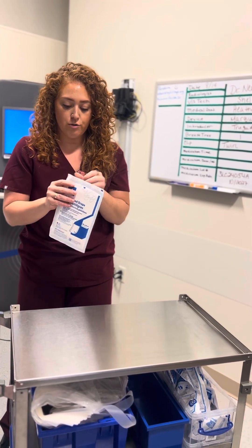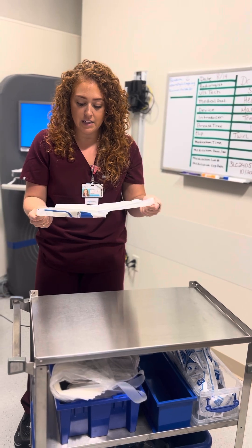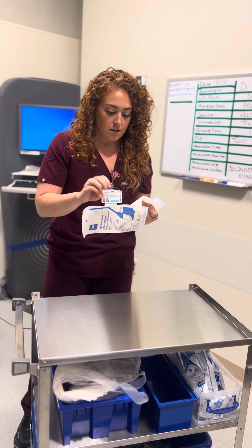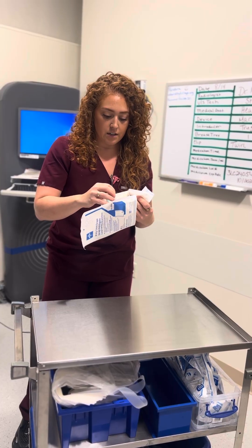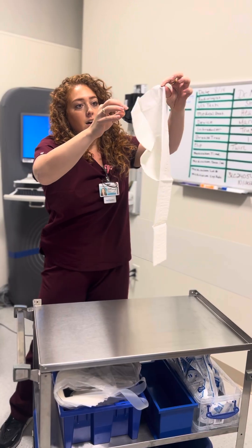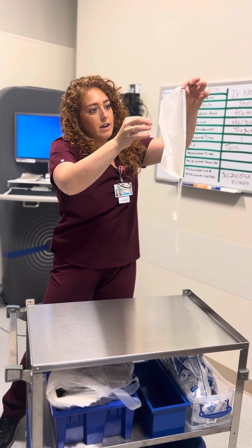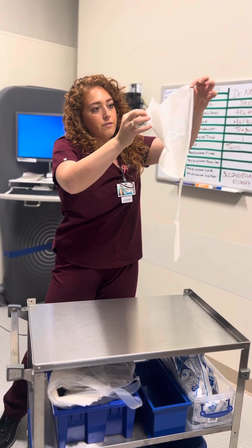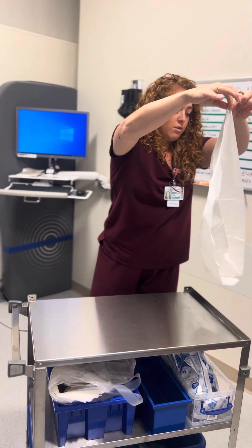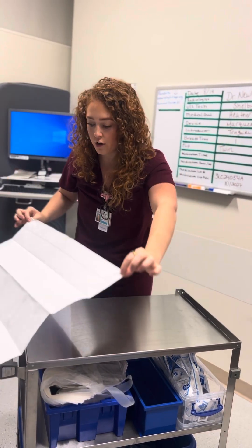I'm going to take the polyline drapes and open those so I can set up my sterile field. My tray is clean — always start with a clean surface. Now these are sterile drapes. Rule of thumb: the one-inch border around them is not sterile. So I'm touching it, but I'm only touching that one-inch border.